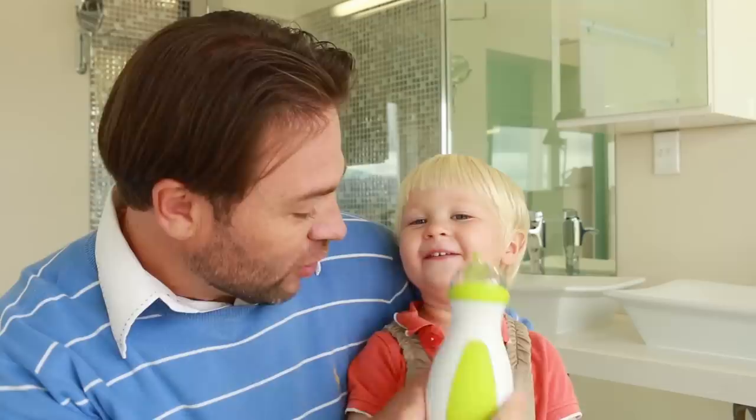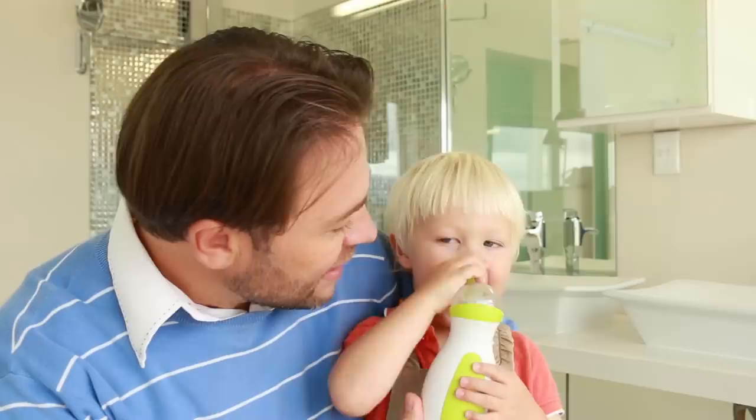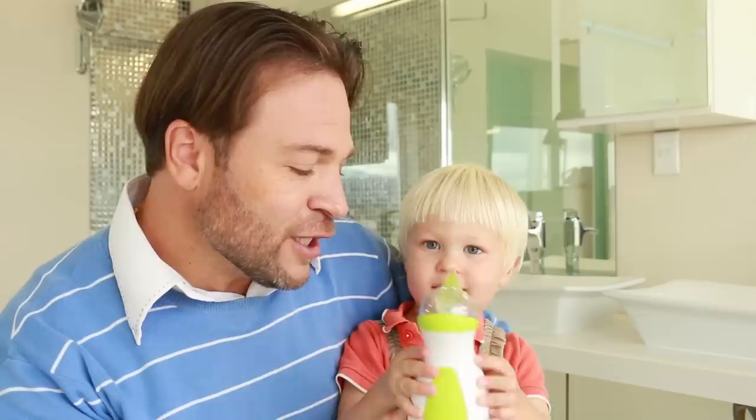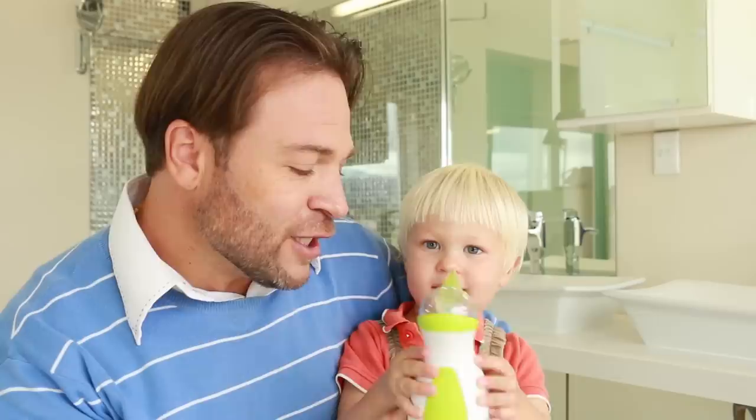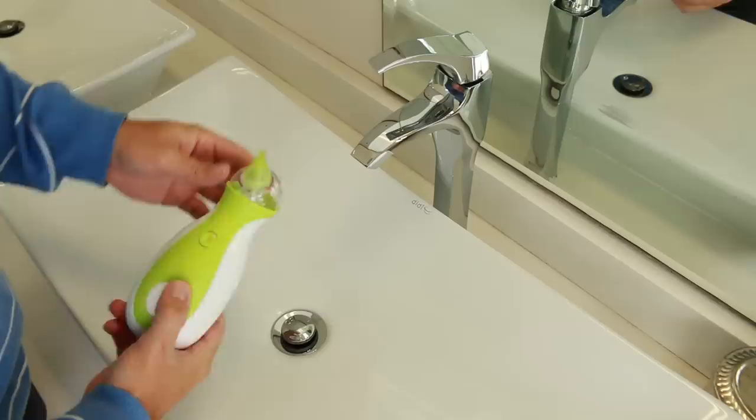It's a tickly feeling, okay? You want to hold it? You hold it and put it in your nose. Such a clever boy. That side's a bad side, eh? I'm finished. Switch it off me. Thank you Mr. Penguin, thank you for making me feel better. Nosyboo Go — you'll see, it's a little bit gross, but there is a fair amount of mucus inside there. It's super easy to clean — we just take it apart, wash it out and it'll be ready for the next use.